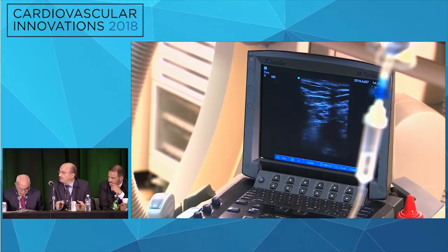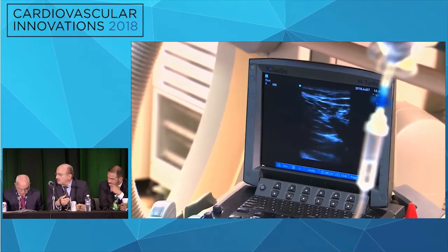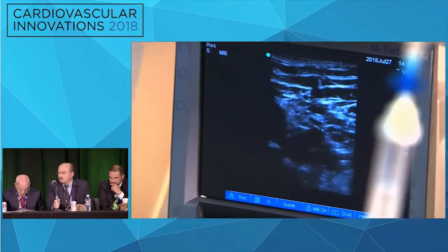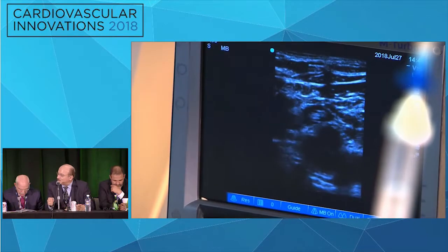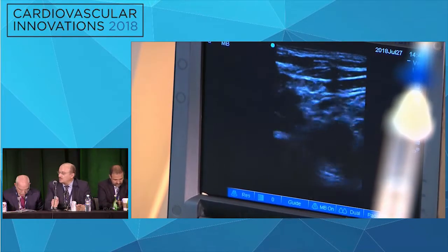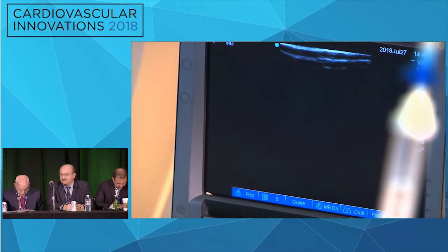So let's look at this ultrasound carefully. They're in the common femoral vein. The problem, yeah, is when we open those veins surgically, there are so many channels. You don't know which channel you are in, because we do endarterectomy for them, and you see tons of channels in that area.